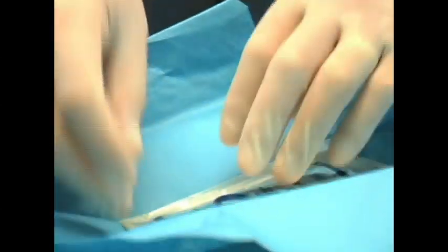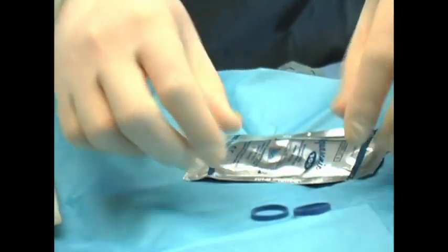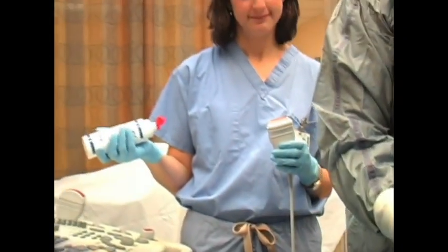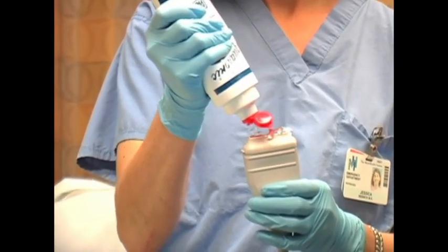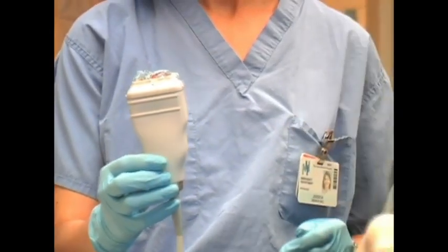Dan is opening a sterile kit that contains a sterile sheath, which will be applied over the transducer, gel that's also sterile that will apply on the outside of the sleeve, and 2 rubber bands for securing the sleeve on the transducer. Dr. Jessica Resnick is now preparing the transducer by putting non-sterile gel on the transducer head.